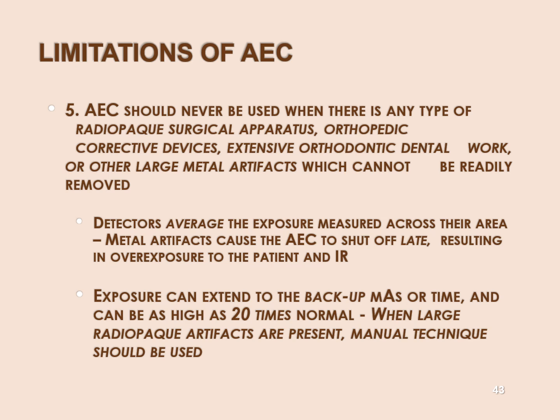You're going to reach backup time more often than not, and you're going to see a white prosthetic, and then maybe you'll see part of the pelvis, and then the rest of the image will be way too dark because you'll be overexposed. Okay, and it'll also affect your histogram. Okay, so what's the better way? You got a manual technique when they have hip replacements, knee replacement, total joint replacement.